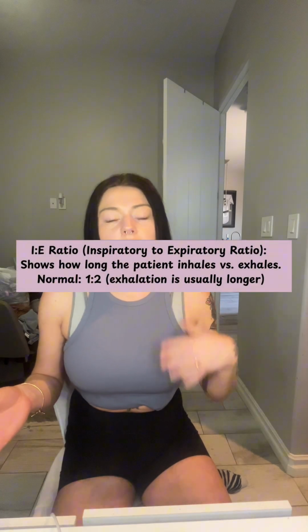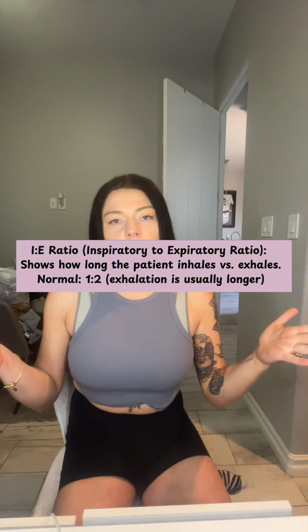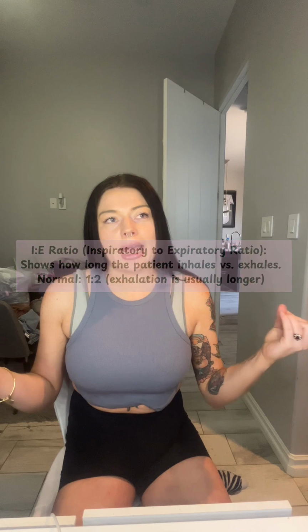So we'll get into what we need to be looking at to ensure the patient is having an adequate inhalation and exhalation process. IE ratio is telling us our inspiratory time to our expiratory time. A normal is a 1-to-2 ratio. Obstructive, you may see like a 1-to-3, even maybe a 1-to-5. ARDS and oxygenation type issues, you might even see an inverse ratio or like a 1-to-1, ensuring the balance between oxygenation and ventilation.